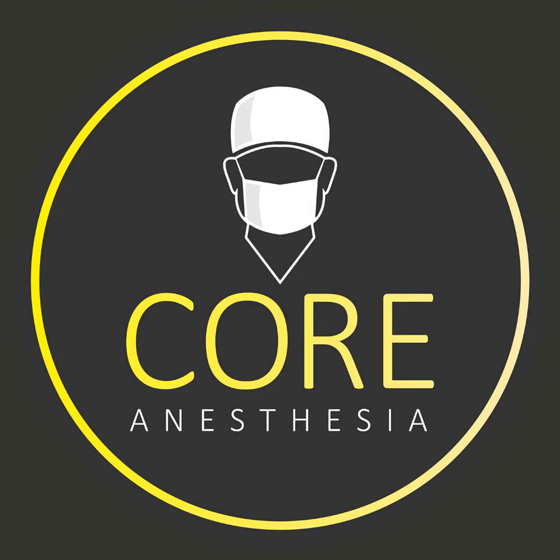This one, in my opinion, is the biggest one of the main monitors that we have on pretty much every patient that we do. Capnography tells you so much about your patient. So first, let's talk about what it is. It picks up on the amount of expired carbon dioxide. You can use this on a nasal cannula, with a mask, in your circle circuit. Really anything that we do, we can hook this up and get a picture of what our patient is expiring.